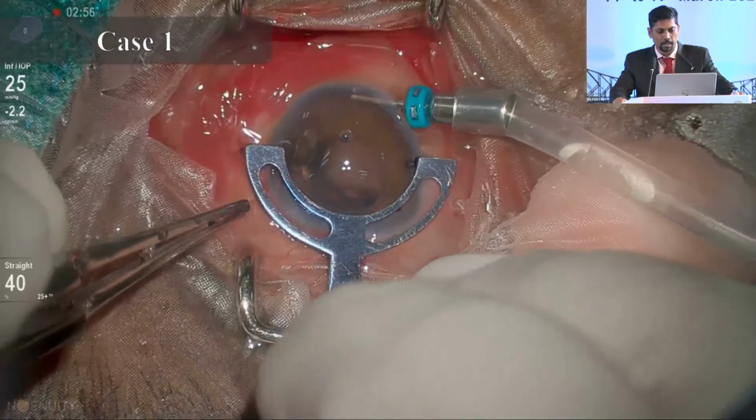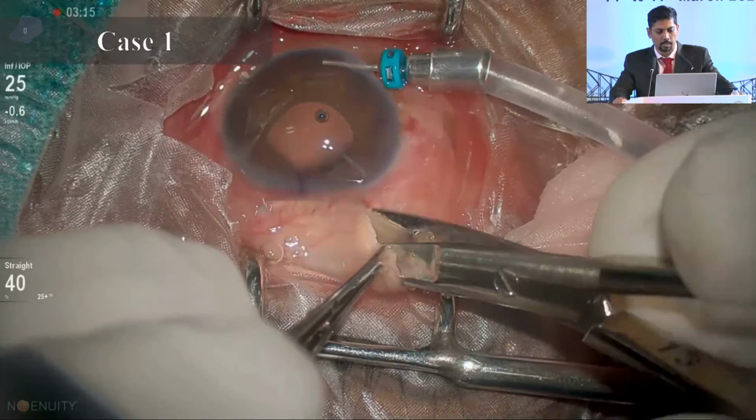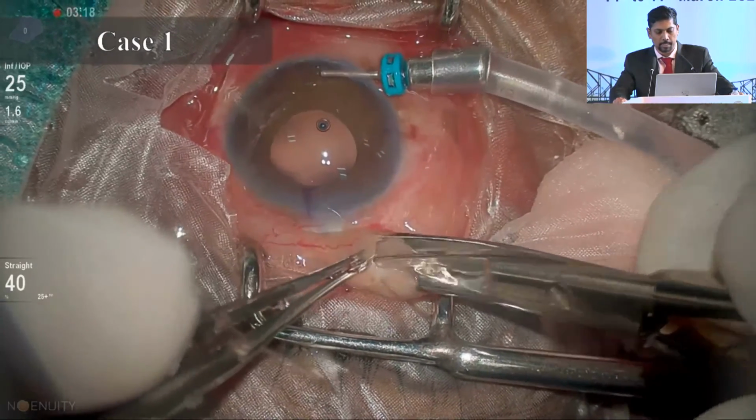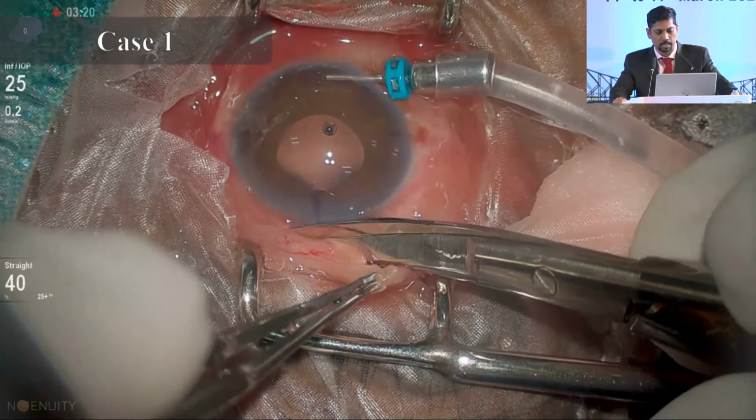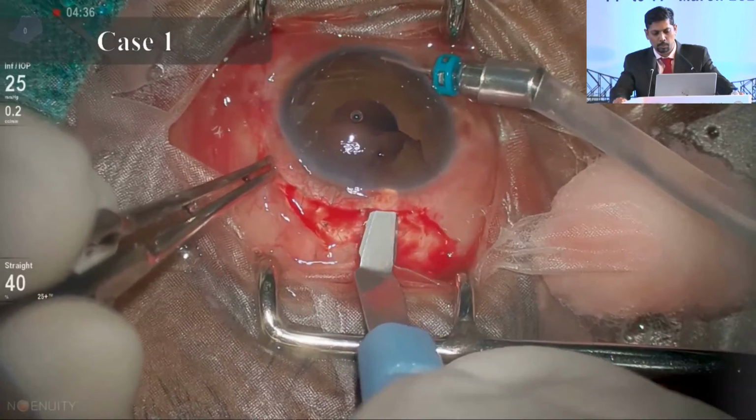After that, mark the meridians 180 degrees apart, and I'm trying to open up the conjunctiva here. There is a large section over there. I'm trying to avoid that and trying to create a fresh one as much as possible.